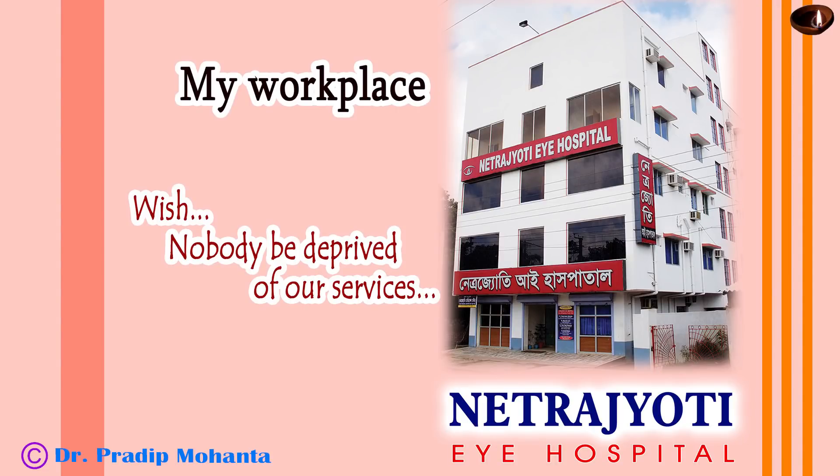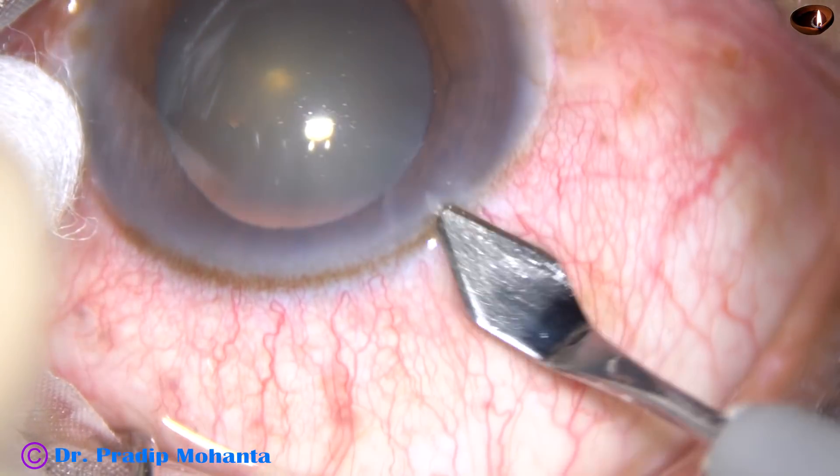Dear colleagues, welcome to my hospital at Ranaghat, West Bengal, India. This is phacoemulsification of a soft cataract.